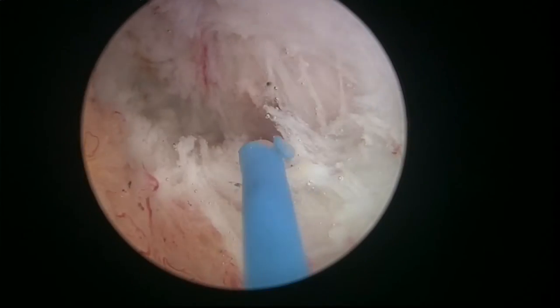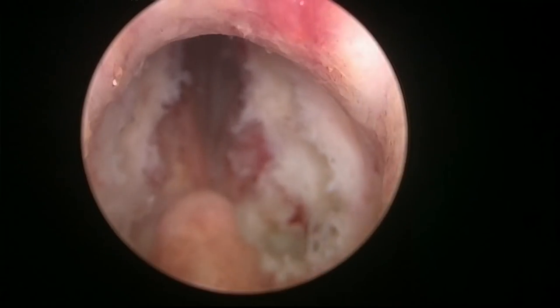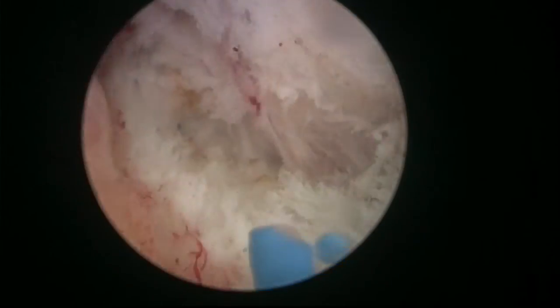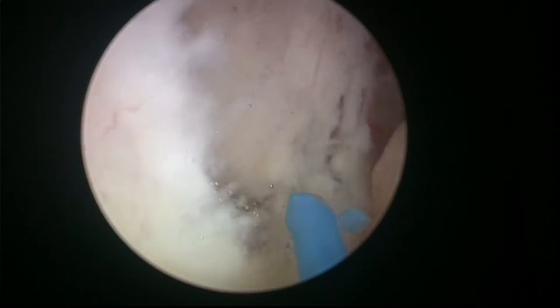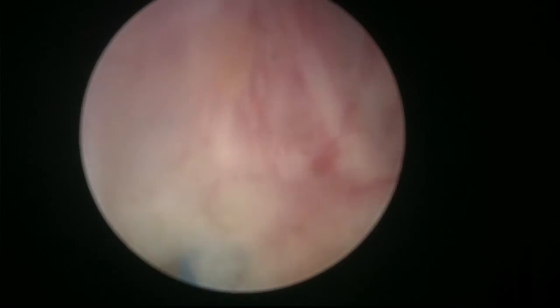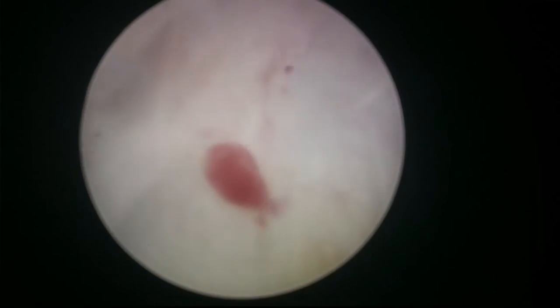When the visibility is good like in this case, I think it's a good idea to deepen the white line a little bit, because it will help you a lot to have a nicely established groove separating the tip of the adenoma from the sphincter. It's nice to cut these fibers that join the sphincter to the adenoma because that gives very good protection of the sphincter and its mucosa. That's the final cut on the mucosa cranial to the vermontanum that will complete the white line.